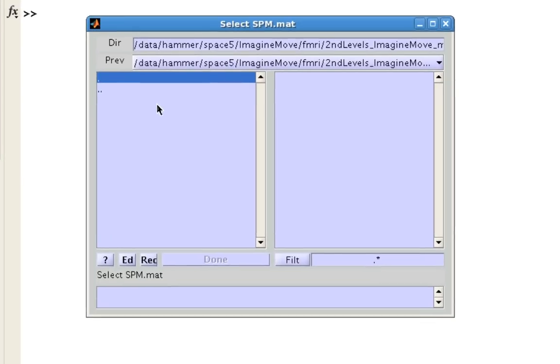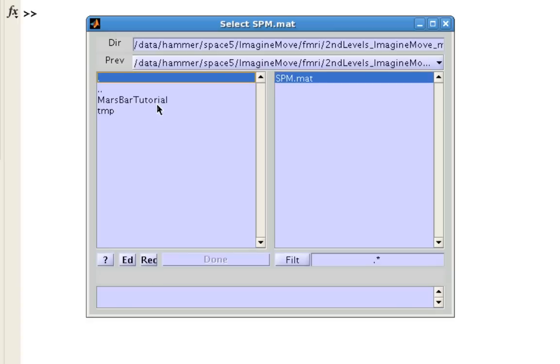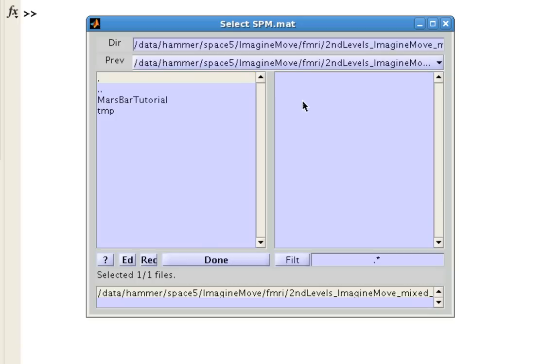So what you're going to do here is select an SPM.mat file, just like you would use to look at the results from any other SPM analysis. And here, I'm in a directory which contains an analysis from a second level result that I ran from a previous study.